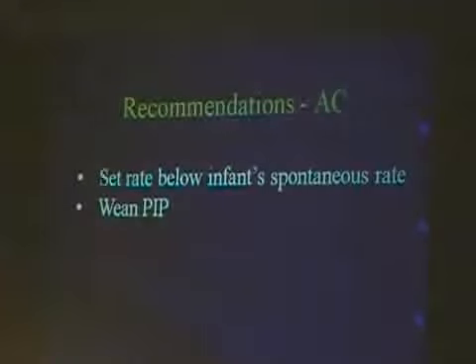The other way, of course, is to use SIMV and then wean your rate off, either to pressure support or something fairly low, and then extubate the baby.